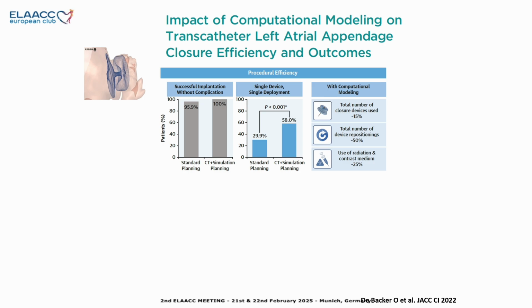And if we go further in the planification, using computational modeling to simulate the interaction between the device and the LAA, we see in this paper published by Ole and the co-workers that the use of FEops and computational simulation is associated with a decreased number of devices used, a decreased number of repositionings, and less radiation exposure.